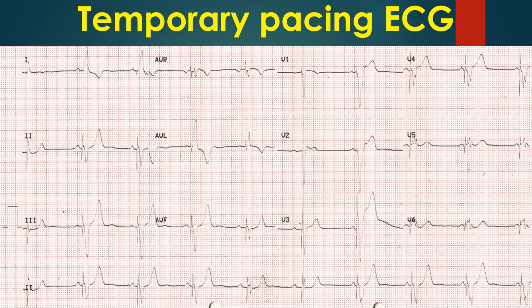ECG shows a pace rhythm at around 60 per minute with pacing spikes preceding each QRS complex. At first look, it may seem that there is P wave before each QRS with a reasonable PR interval suggesting atrial sensed ventricular pacing, A-sense, V-pace, sequence or tracking. But close scrutiny shows that PR interval is gradually varying. The atrial rate is also close to 60 per minute, making false appearance of an AV synchronous pacing in some beats.